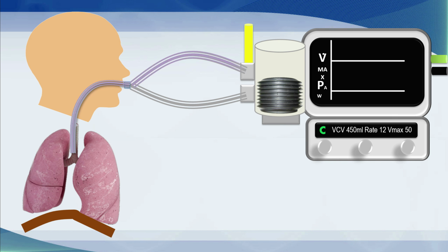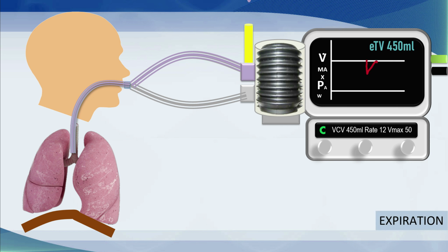And here is the gas flowing through the system. You can see that during expiration, the bellows refills. Sometimes when we come to IMV, you'll see there's a bag that refills during this. On the flow waveform, you will notice the expiratory flow pattern, which is the same as you'll see in all of these waveforms. It's that elastic recoil flow.